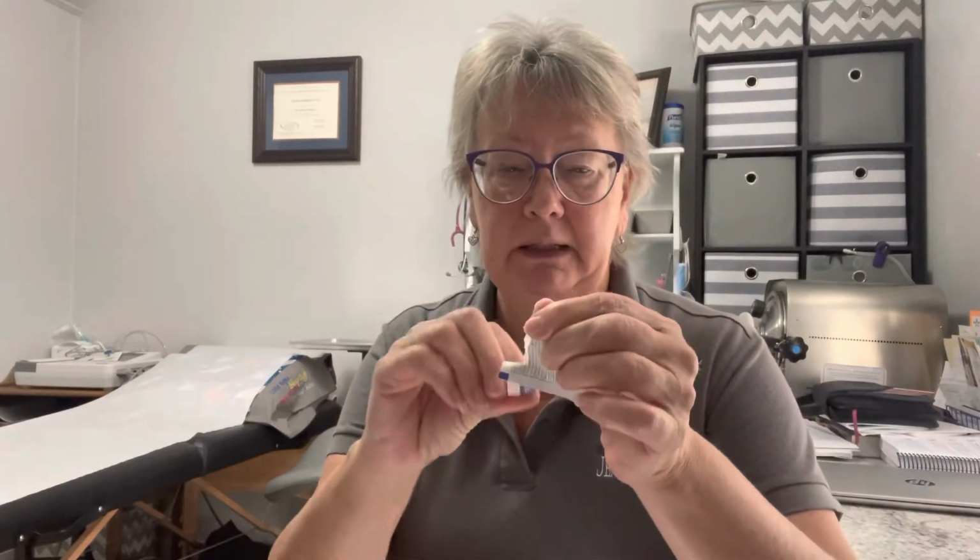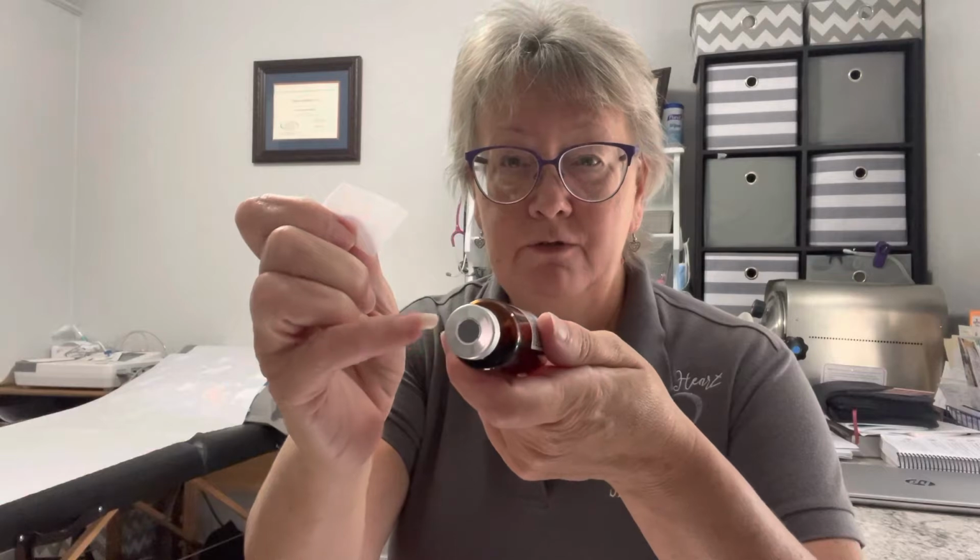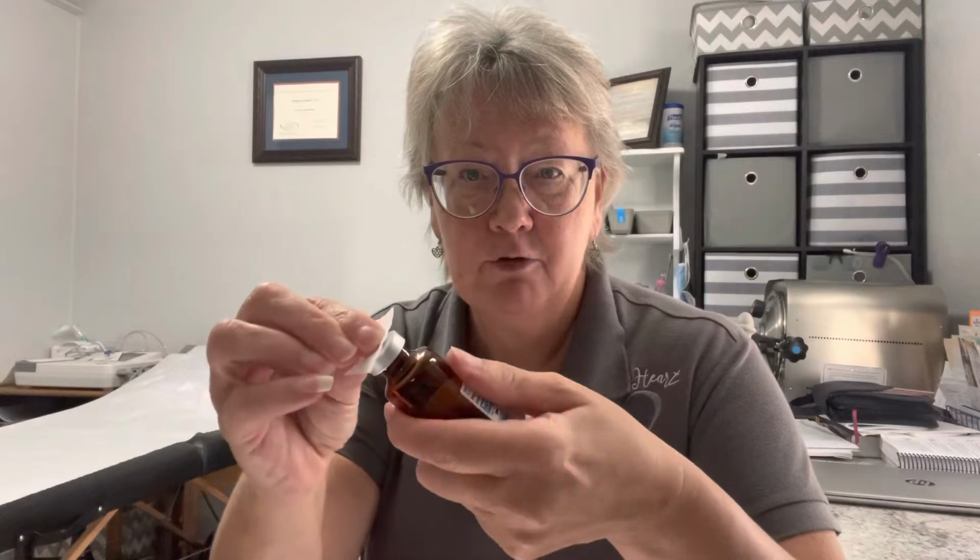The first thing we're going to do is open our alcohol pad and make sure that the metal center has been removed from your medicine. A brand new vial will have a little metal cap there. You pop that off so that you see the little rubber center. So we're going to press into that and alcohol that off really well. We're going to let that air dry.